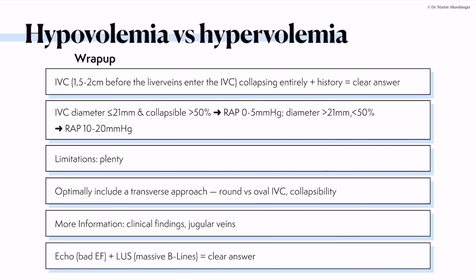There are some pitfalls, for example, in a patient with ARDS. So if you have skipped areas, you should scan more areas of the lung, that can be a pitfall. So also keep in mind that there are distinct differential diagnoses in evaluation of the heart and the lungs.